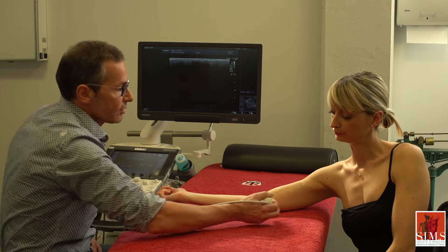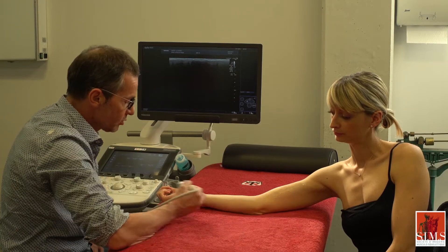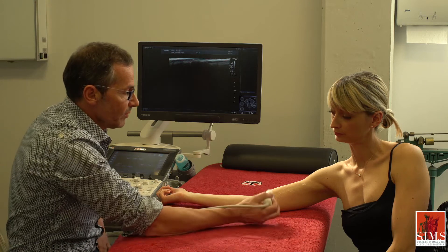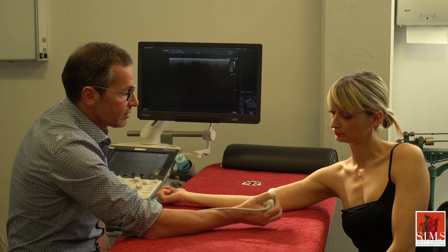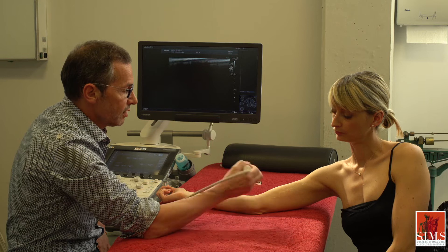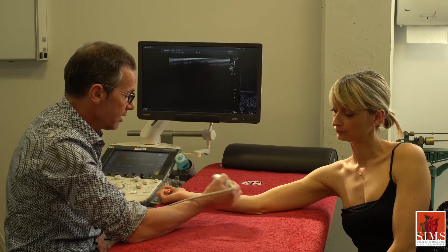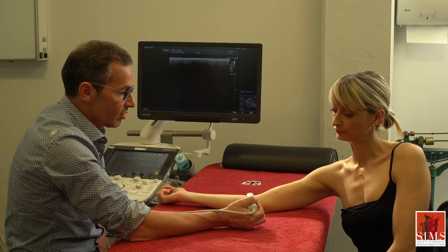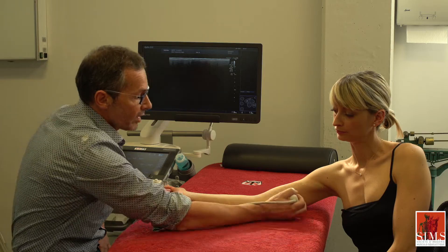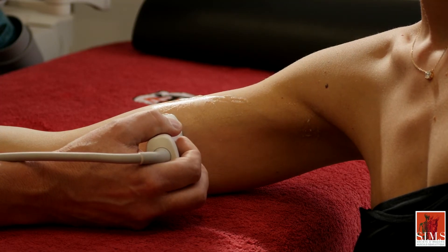The ulnar nerve extends from the medial cord of the brachial plexus to the wrist. To facilitate its examination, the patient is seated facing the technician with the arm in abduction. The elbow rests on a hard surface with the forearm externally rotated so the medial side of the arm can be reached adequately.